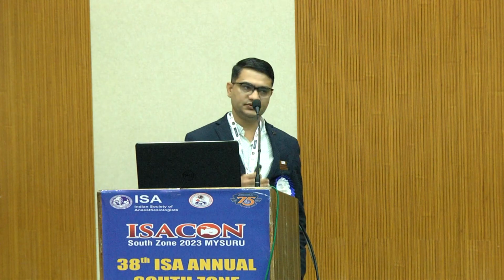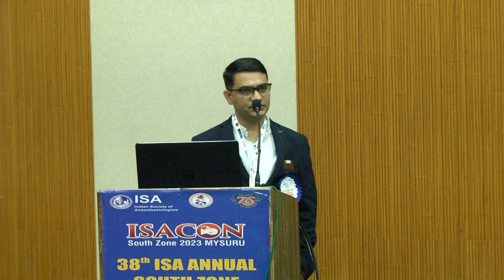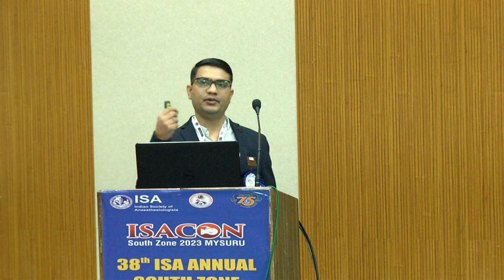So based on this, we have oxyhemoglobin and deoxyhemoglobin, which absorb differentially. Oxyhemoglobin absorbs infrared and deoxyhemoglobin absorbs red light. That's why it's very easy to remember: if you see arterial blood, it looks more bright because it does not absorb red light. It reflects. So that's why it looks more bright and more red. Deoxyhemoglobin, contrarily, looks darker.